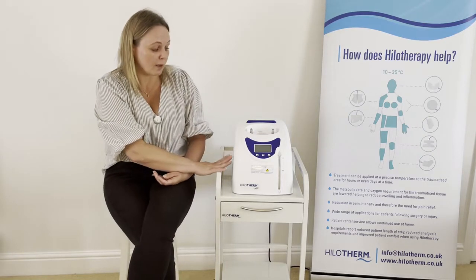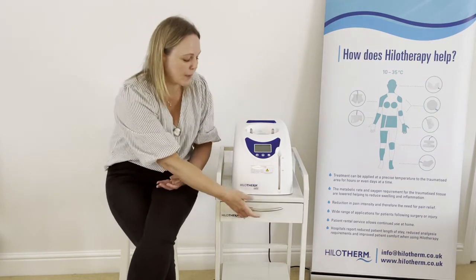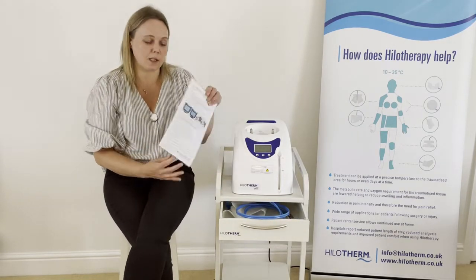Many of the Hilotherm clinic devices are supplied on the trolley — yours may or may not be — but if it is, please make sure to look out for this laminate.